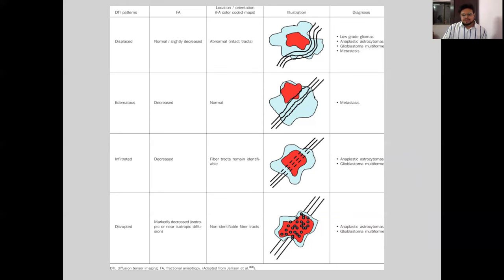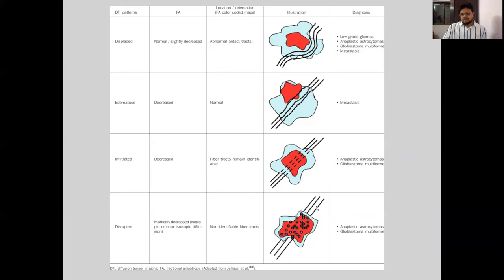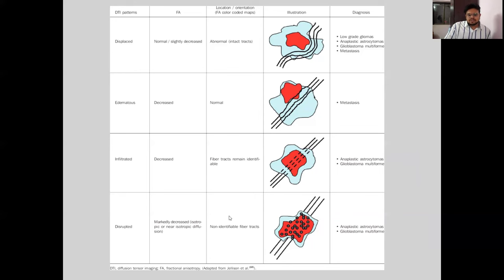The fiber tracts remain identifiable in infiltration cases. However, in extreme cases of high-grade gliomas like glioblastoma multiforme and anaplastic astrocytoma, there is complete disruption of white matter tracts and a resultant marked reduction in fractional anisotropy, and white matter tracts are non-identifiable.